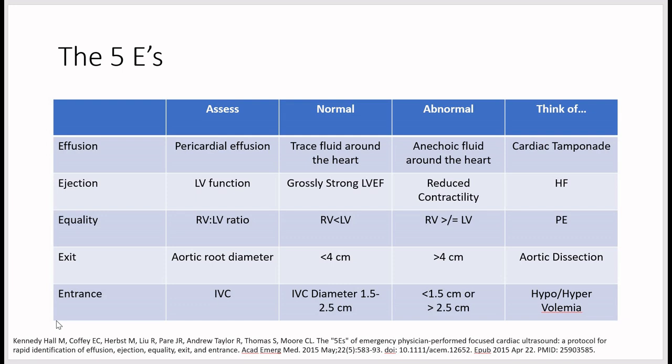For exit, assess blood exiting the heart by measuring the aortic root diameter. Less than 4 cm is normal; greater than 4 cm is abnormal. A dilated aortic root with pericardial effusion should raise concern for aortic dissection.